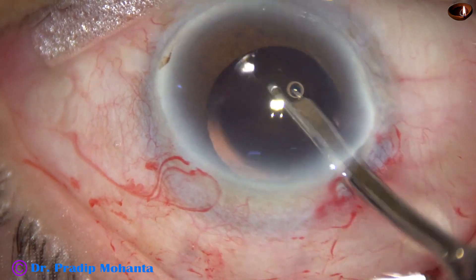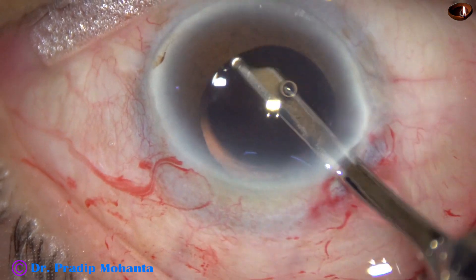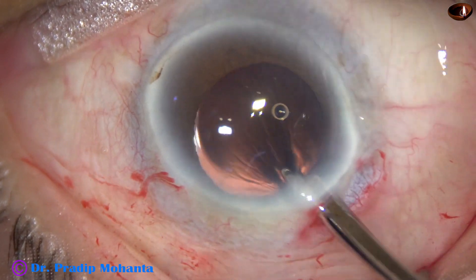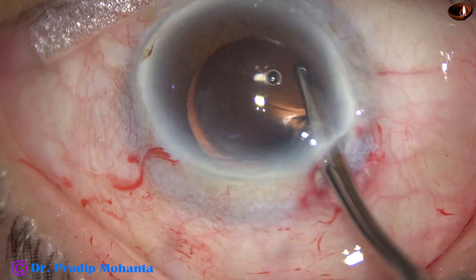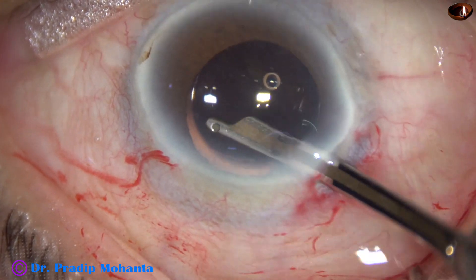When the fluid is over, about 5 cc of fluid is irrigated and already there is irrigation. Irrigation is also done through the aspirating port. And thus a lot of visco molecules come out just by irrigation. As the fluid gets over, irrigation and aspiration is carried out.